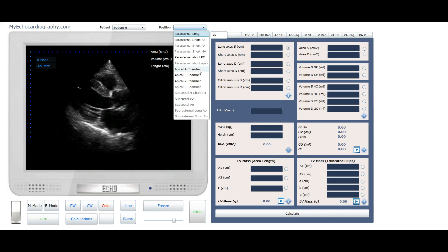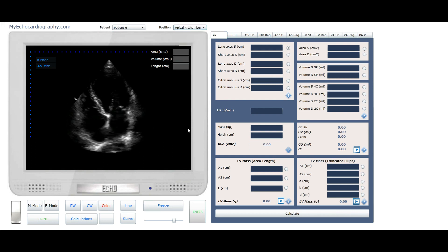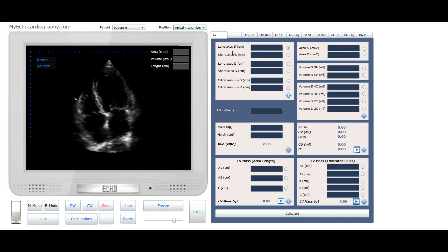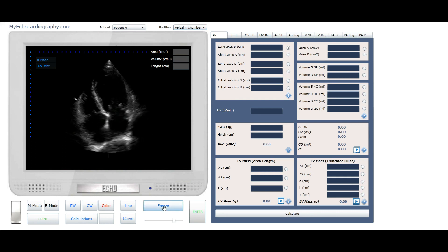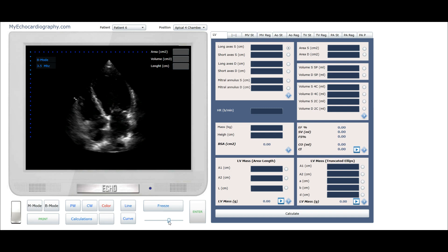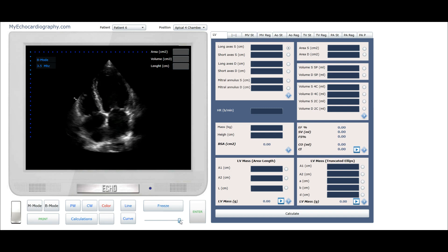Let's assess the systolic long axis of the left ventricle. Freeze the image and find the end systolic position. Click the button Line and start measurement of the long axis of the left ventricle.